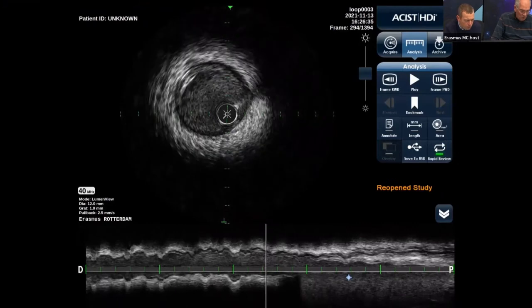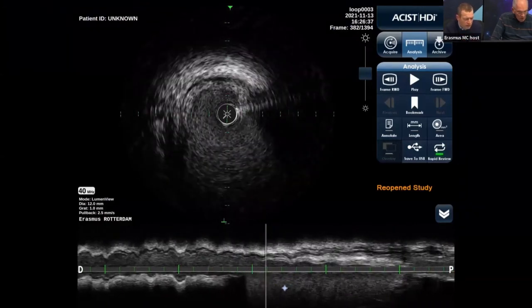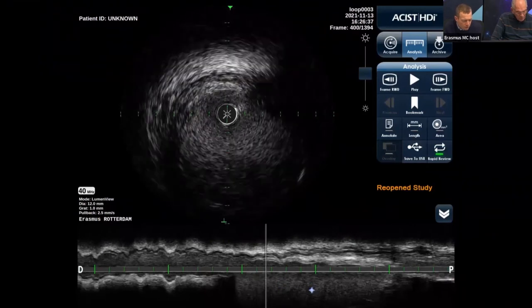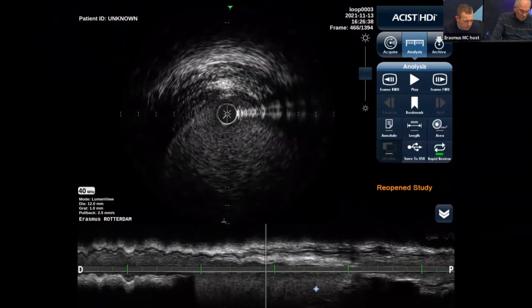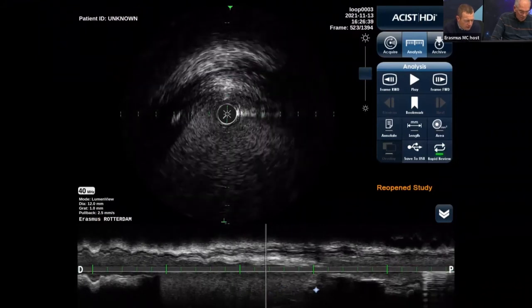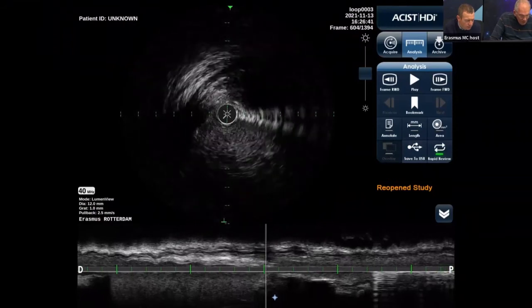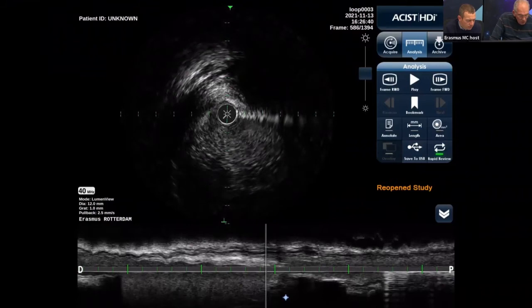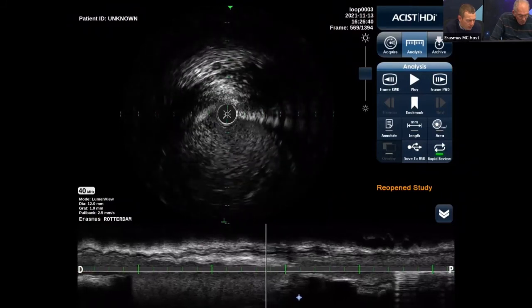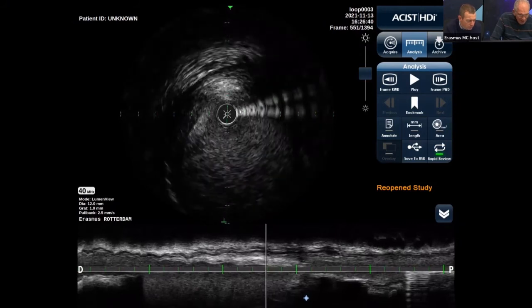So we now have confirmed that this plaque rupture is just at the neck of the aneurysm. So what if we would tailor a short stent, starting at the inflow of the aneurysm? Let's do that. But you don't want to cover this small piece of thrombus. Shall we put it in here?